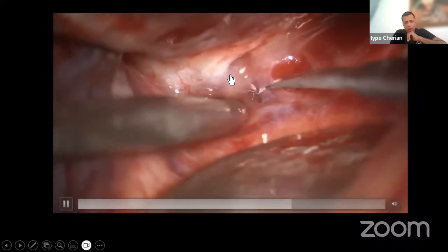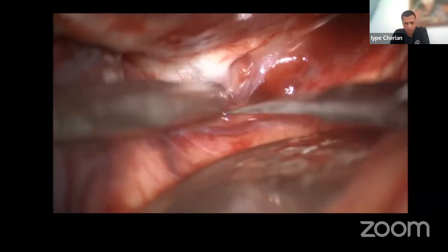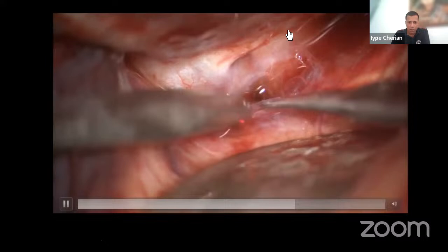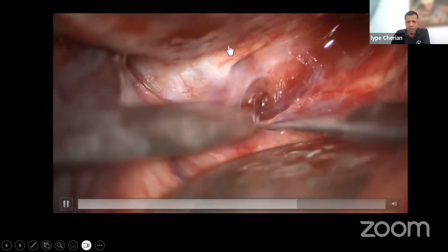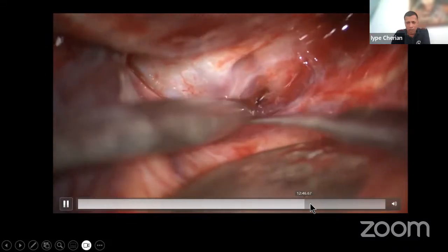If you have not done this bone work, it's just impossible to be easy about it. What other people generally do is they open like that, and then they drill the clinoid intradurally, and then they try to clip. But here, there is no clinoid at all. Everything is taken out. That's optic nerve, and that's aneurysm. So I'm going to cut.